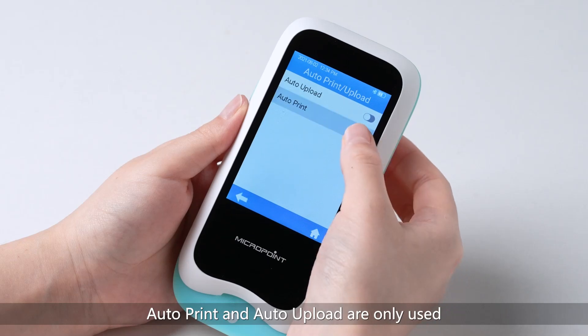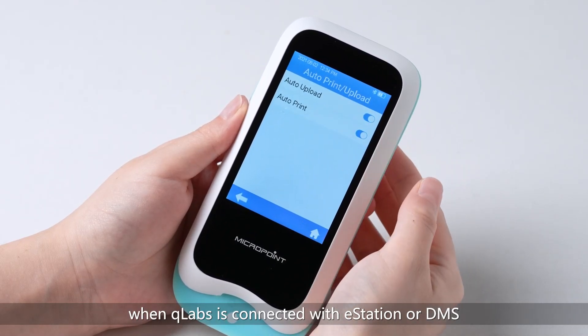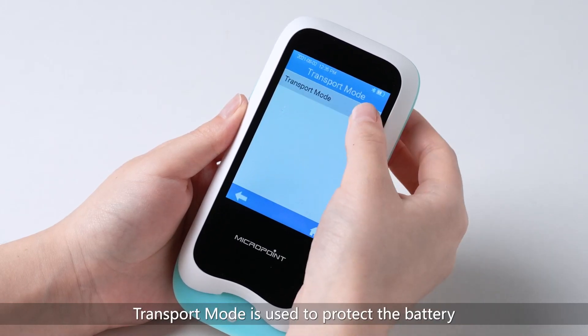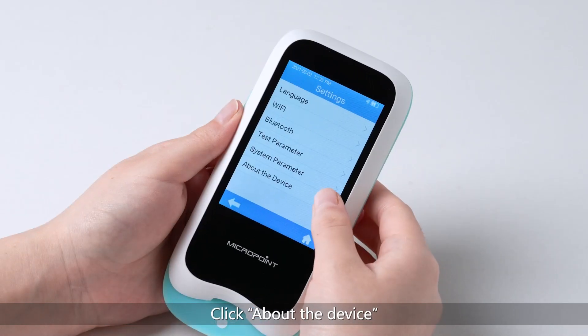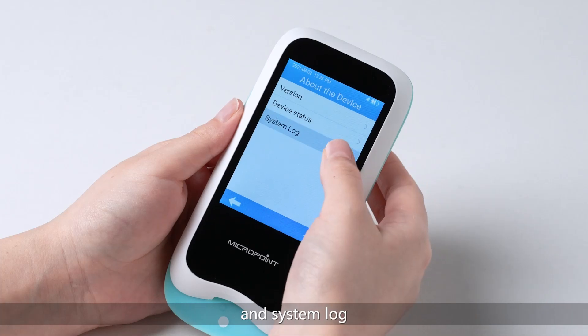Auto print and auto upload are only used when the Q-Labs is connected with the E-Station 2 or DMS. Click to turn on or off the transport mode. Transport mode is used to protect the battery during long-term storage. First time use when new, or after long-term storage, connect the Q-Labs with external power supply — the transport mode will turn off automatically after the Q-Labs starts booting. Click About the Device to check the version, device status, and system log.